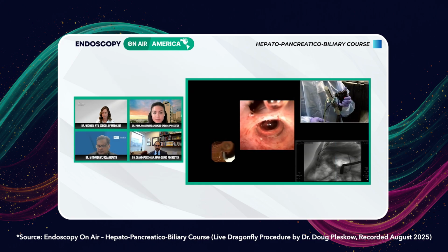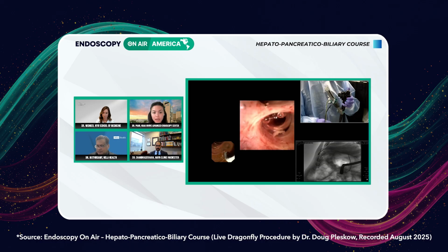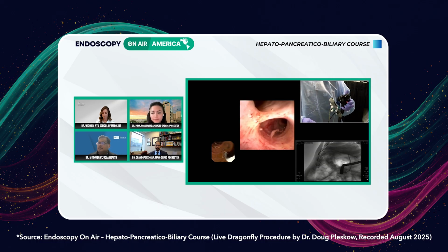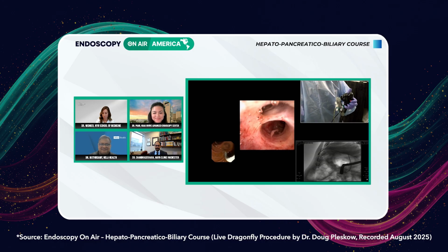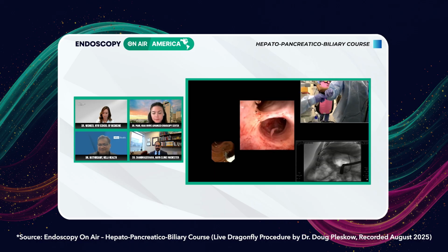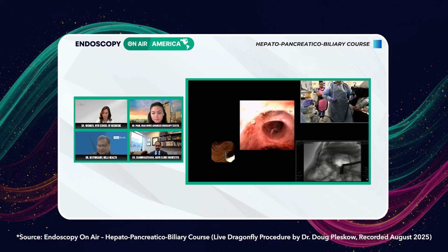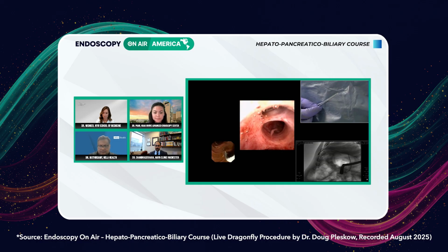Do you find that with a bigger channel, you have to use less technical deviations in order to get the biopsy forceps up to the hilum, that it kind of runs smoother? So we've developed this thing, we call it walking the dog, which Jermaine will open and close the forceps, and we're going to show you the tip of the forceps here against my gown first, which is right here. So we can get a magnification up on that. And you can see that, keep going a little bit more magnified, please.